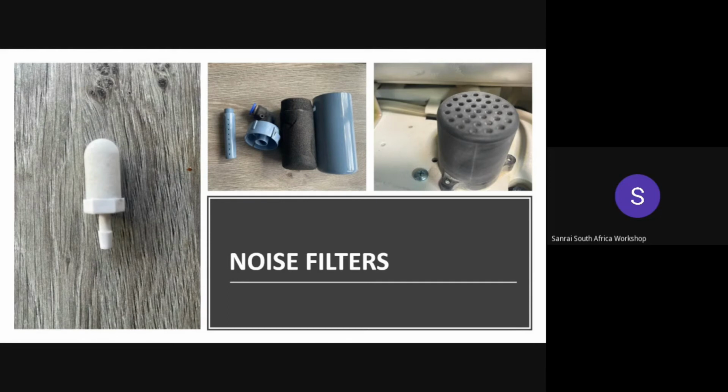The reusable mufflers have sponges in them that absorb the noise. These sponges do not get damaged, as their purpose is only to absorb the noise, but they can get clogged with dirt and zeolite. So it is important to check and clean them if needed.